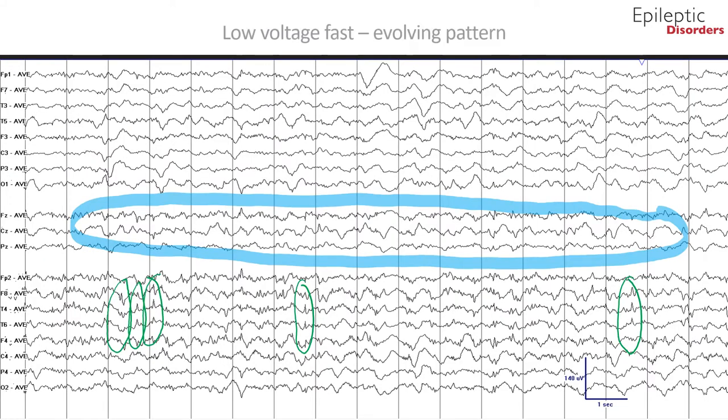The same page shown in average montage: you can see sharp waves where the previously well-defined phase reversals were, with some examples outlined in green. Furthermore, there is further evolution of the seizure with delta slowing noted towards the end of the page, and the field evolves with spatiotemporal spread to the central midline channel CZ, as noted by the higher-amplitude delta slowing.